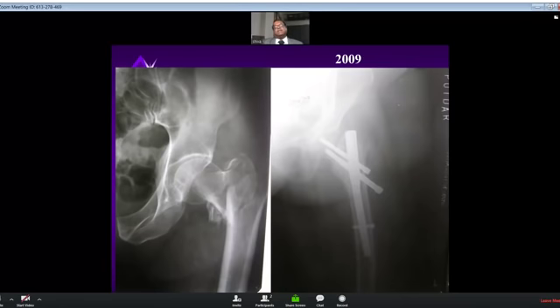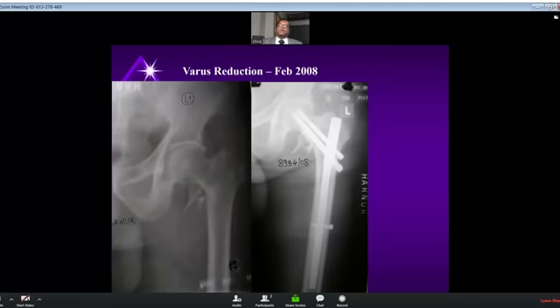Friends, I have been seeing this. Many of them are my own cases which happened in my own hands between 2000 and 2010. But since 2010, none of this has happened in my hands because of better understanding of the EFN. The only case which has happened after 2010 is a stuck nail. It happened to me in 2013. I'll show that subsequently.